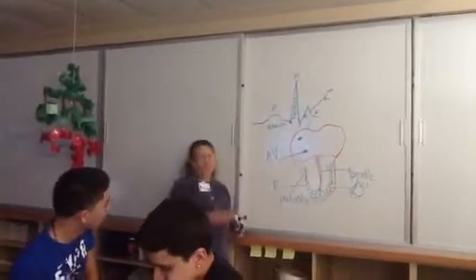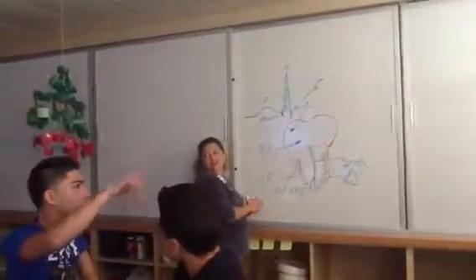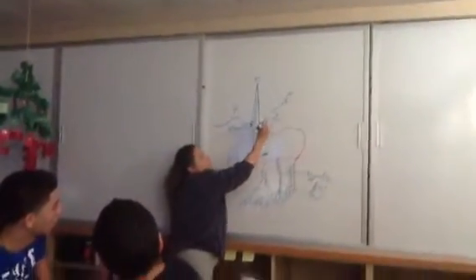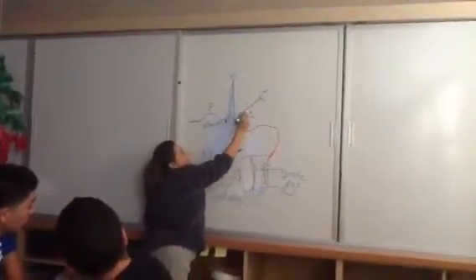I always had the image that it was always like that, and then the small little T wave. No, when you see it abnormal, it affects the electricity, because potassium is a positive charge ion, right? Every time it's charging, it introduces something to the electricity.